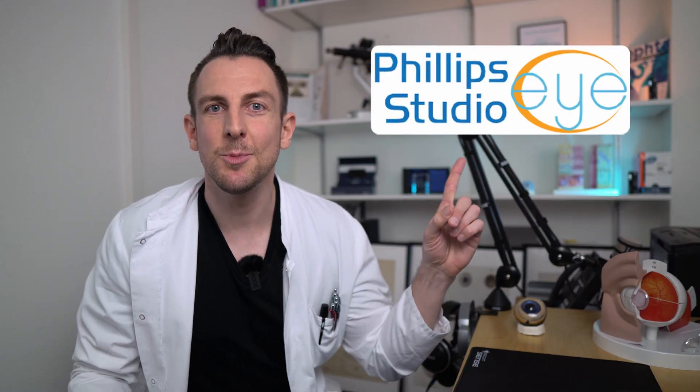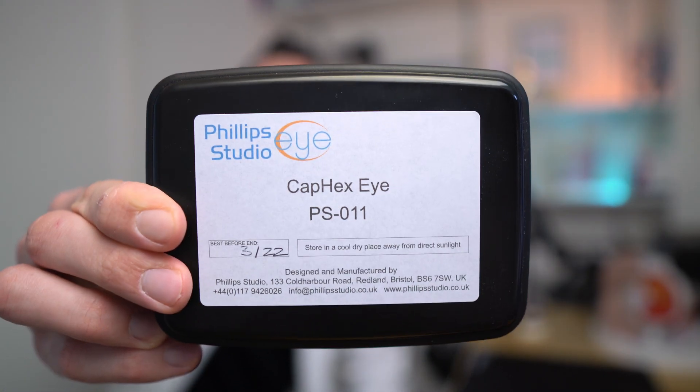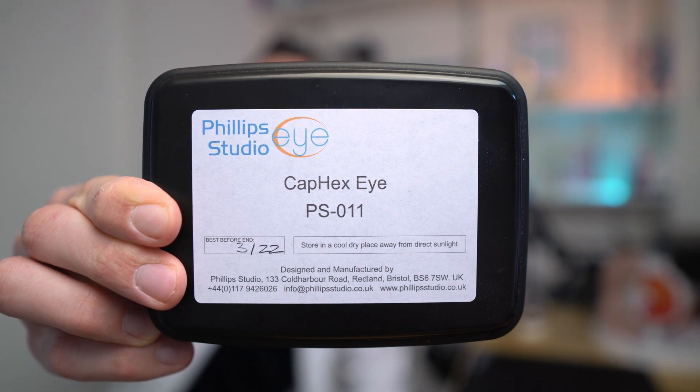My friends over at Phillips Studio Eye were nice enough to send me a sample of their PS011 CapHex Eye, an eye that is supposed to help you get better at your capsulorhexis. Let's see what's in the box.